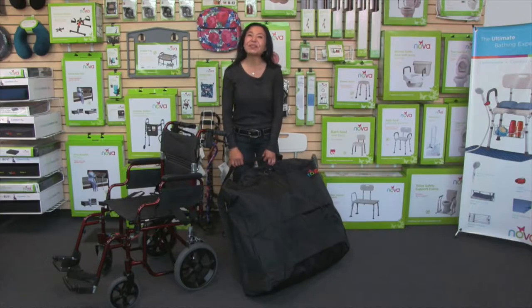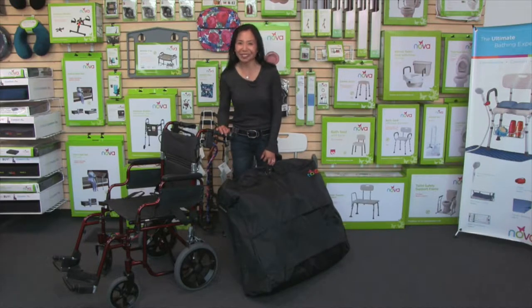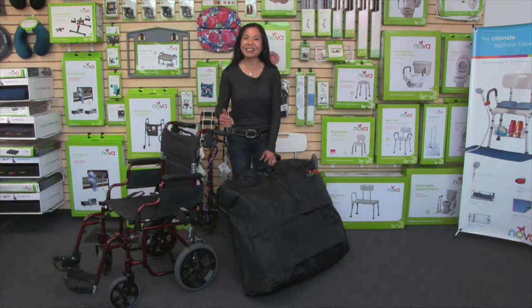Hi, this video is about the Nova Travel Bag for rolling walkers and transport chairs. In the early years of Nova, our customers started sending us pictures of themselves posing with their Nova in great places all over the world, like Paris and on a safari, and we thought we've got to make a travel bag for their walker.